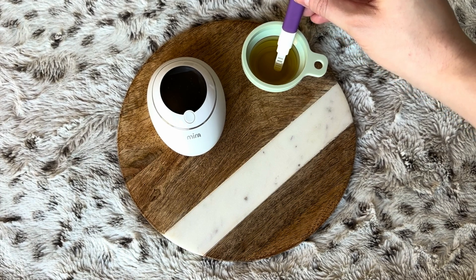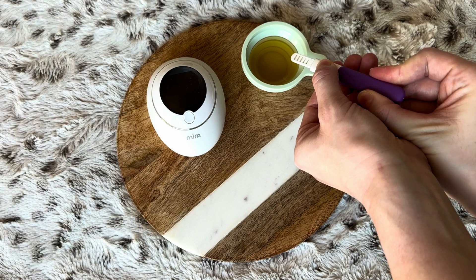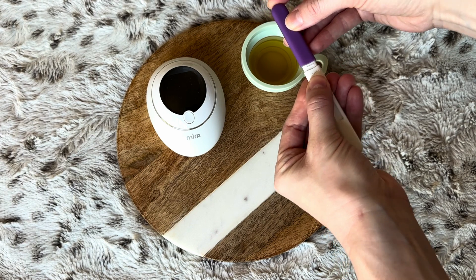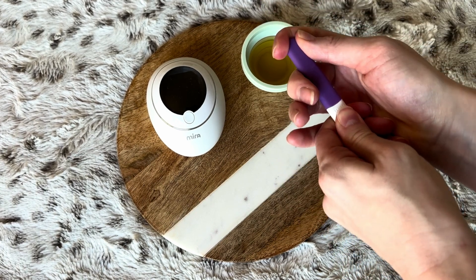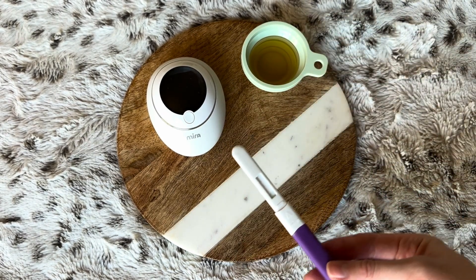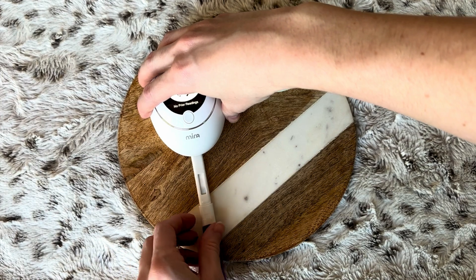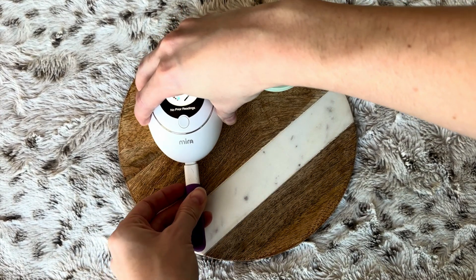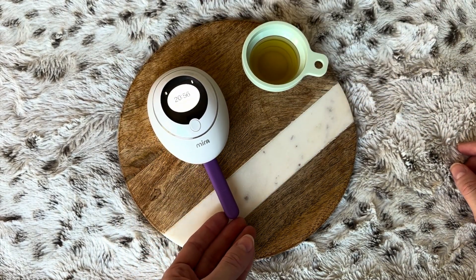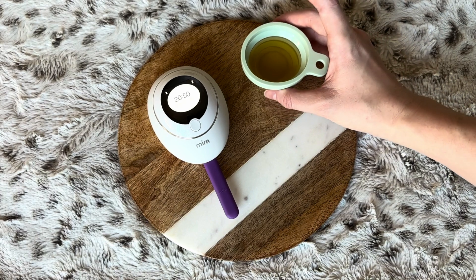After dipping your test wand, switch the sanitation cap over to the sampling end. Keep the sampling end facing downward and always keep the triangle on the wand pointing up — do not hold the sampling end upside down. Next, insert the wand into the Mira analyzer. Keep the analyzer on a flat surface, insert the test wand toward the triangle, do not insert the sampling end into the analyzer, and do not move or shake the analyzer while the test is in progress.